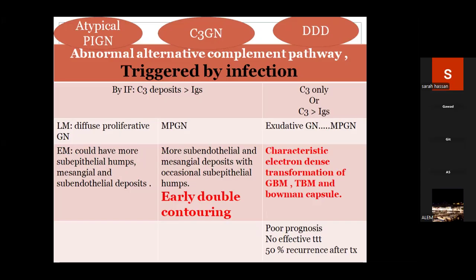So it means that it is markedly injured, and the rapid process causes this healing MPGN pattern with more segmental sclerosis probably. In dense deposit disease, it may be totally an exudative GN that is very misleading under the light microscope, and as we have said, dense deposit disease is an electron microscopic diagnosis.